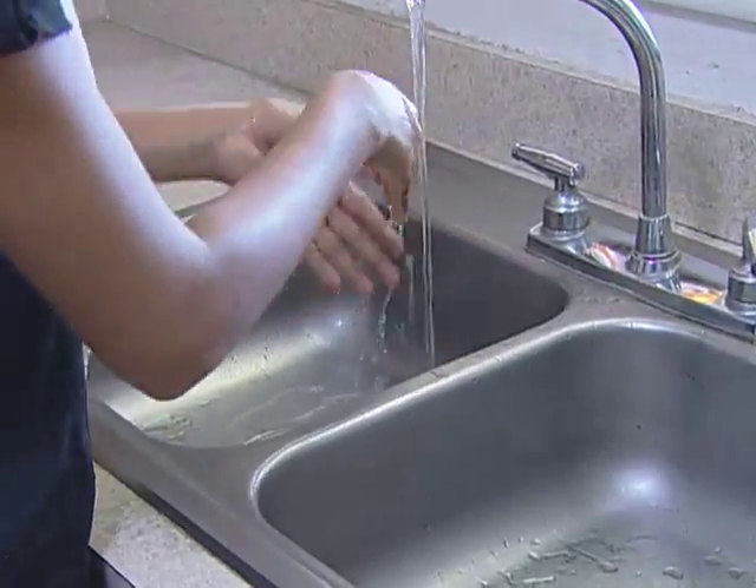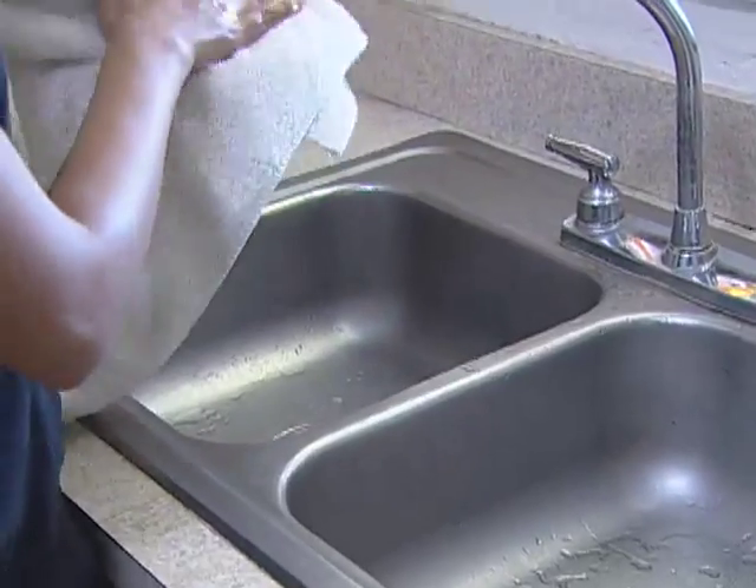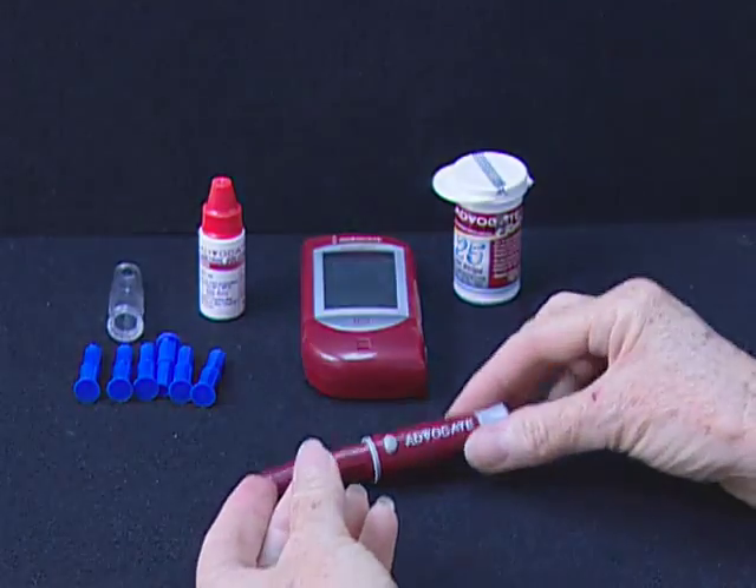Before starting, wash and dry your hands. Step 1: Set the lancing device.